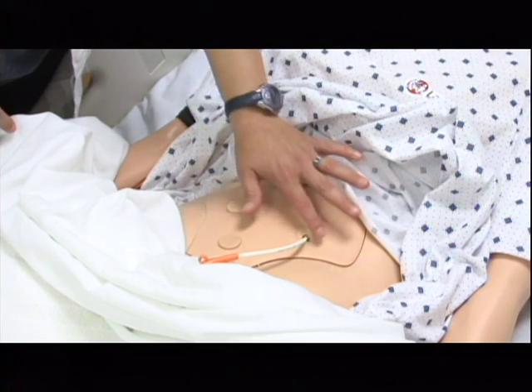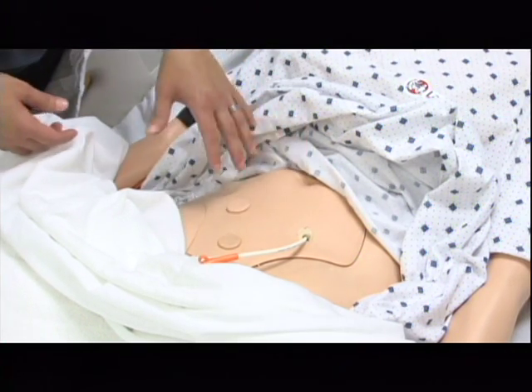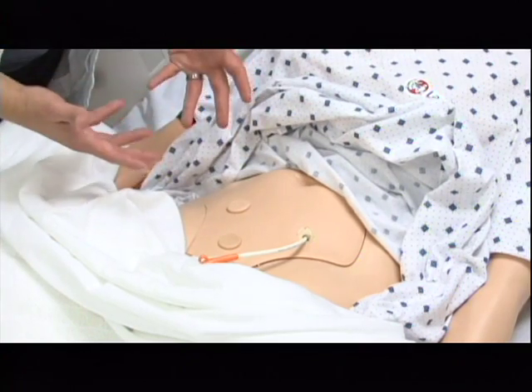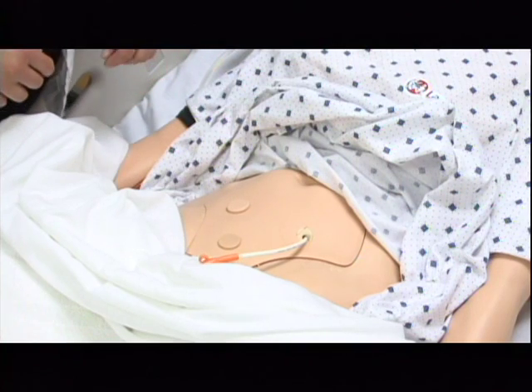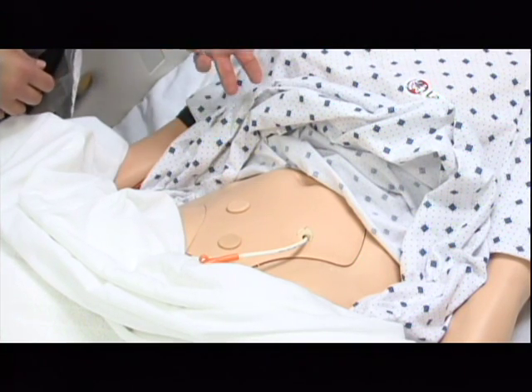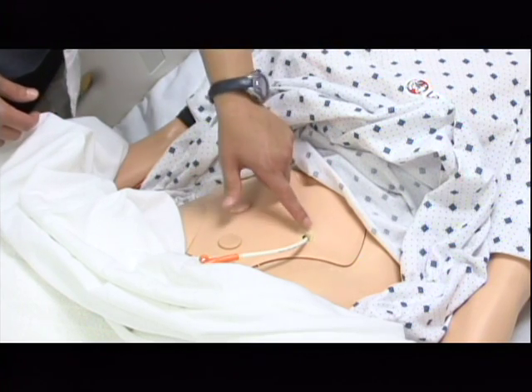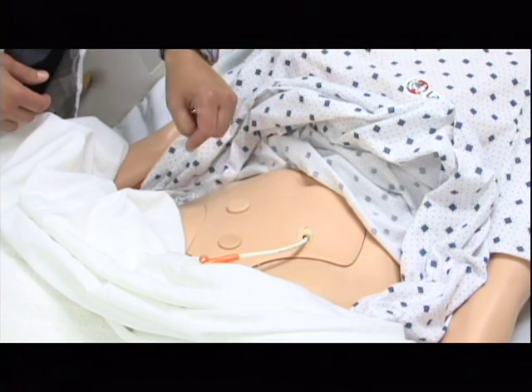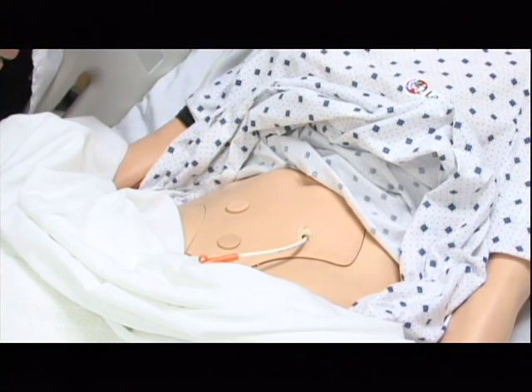You always need to assess the area here for excoriation. And of course, you might need gloves if you're going to be moving on to the palpation piece and touching anything. I'm noticing that she doesn't have any excoriation. Mrs. Smith, how long have you had this tube in? And she's going to say that she's had it for at least a year, so it's an established feeding tube. Thus, there's no sutures or anything like this. There's no excoriation or any areas in here, so it looks good.